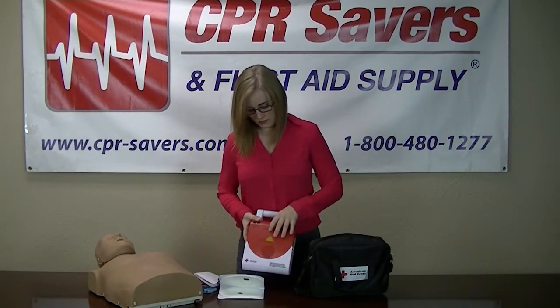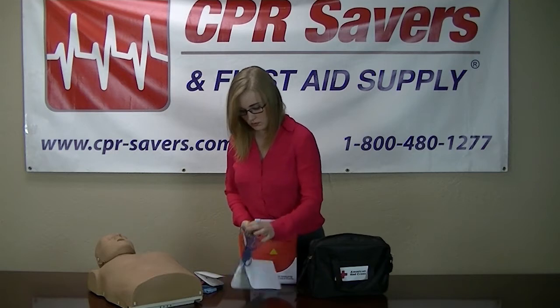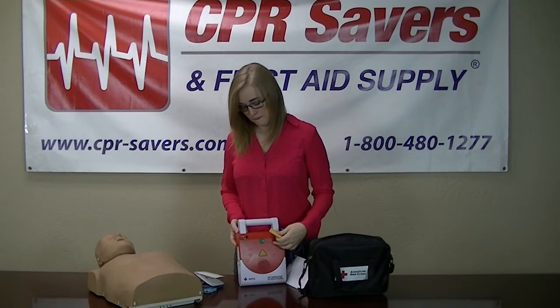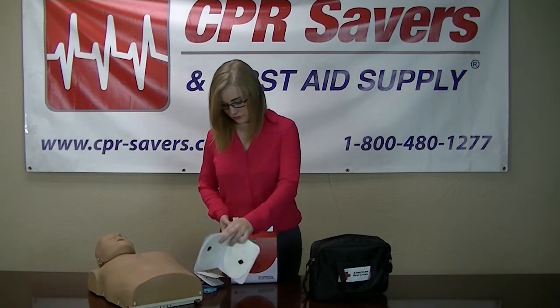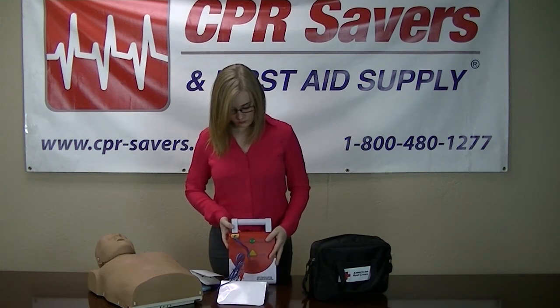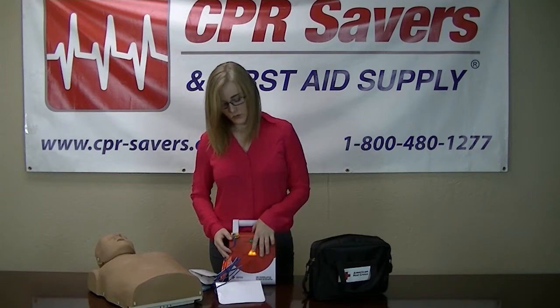When you turn your unit on, you're going to hear a few prompts. You're going to plug in, remove clothing from the person's chest, analyzing rhythm, everyone stand clear. Shock advised. Charging. Everyone stand clear. Push the shock button.